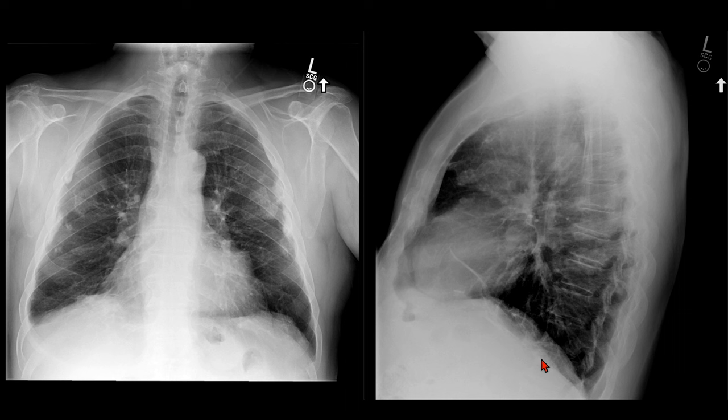This is a case of calcified pleural plaques from asbestos exposure. This patient worked for many years as an insulator and was exposed to asbestos at work.